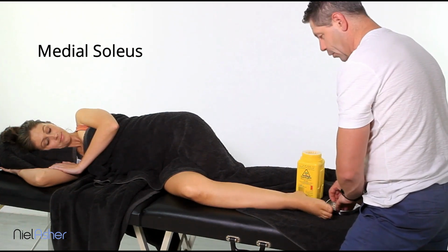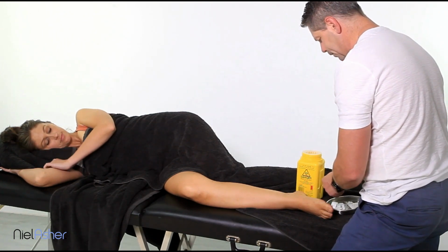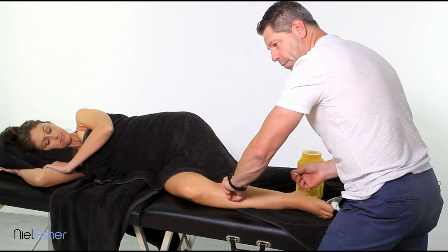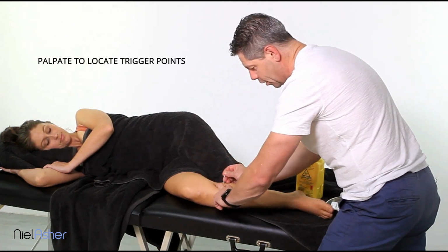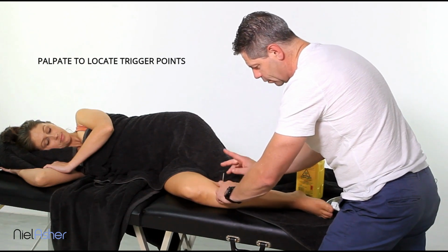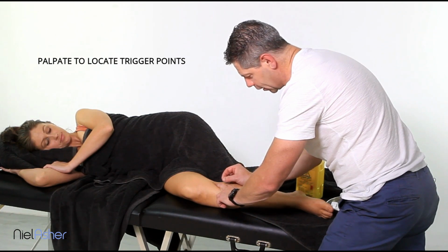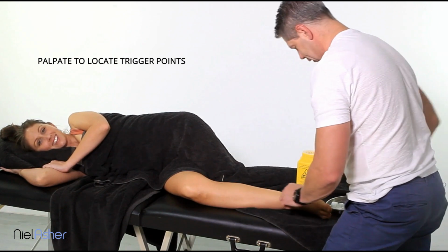So let's make a start. We know where our trigger points are. We're going to use our 50s again. So once again, as I've mentioned before, it is so important that you palpate, find the trigger point, and spread where you're going to be. I'm up against the tibia. Using the guide, place it in, and then I'm just going to come right next to that tibia. Boop, right through there, and that's it there.